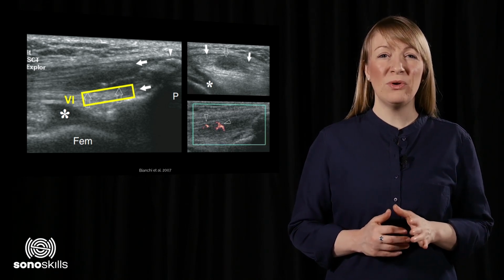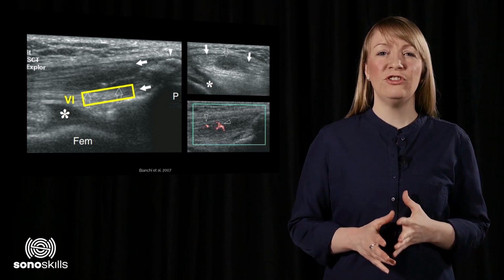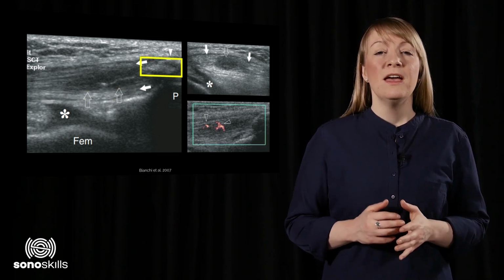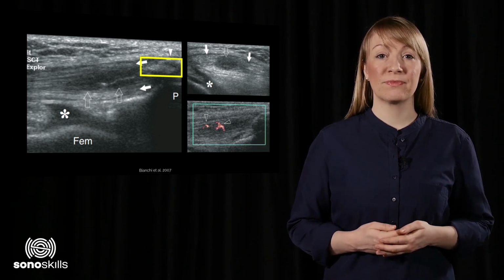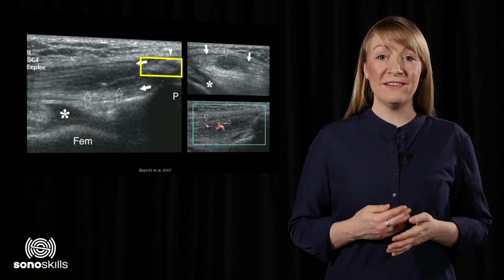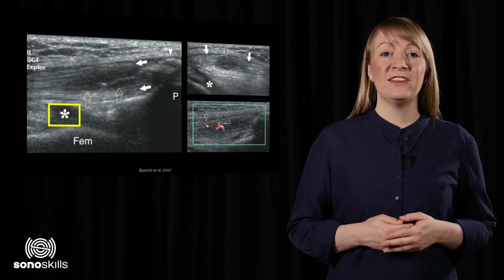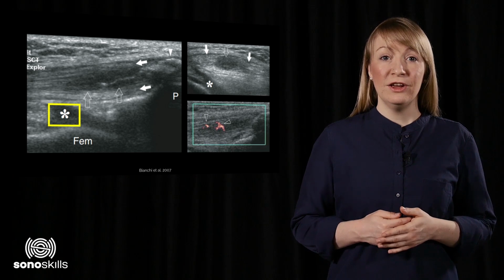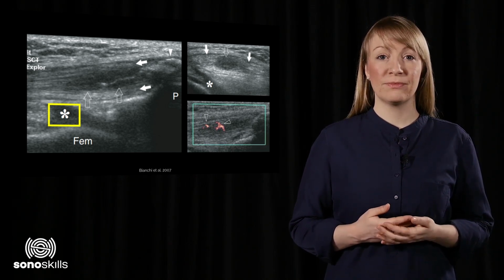They are a little bit more hyperechoic, but this is an artifact of enhanced imaging due to the swelling in the middle part of the tendon. Near the patella, a more hyperechoic zone can be seen. This is due to a pre-insertional calcification. The echogenicity of the suprapatellar recess has turned anechoic due to synovial fluid originating from the knee joint.